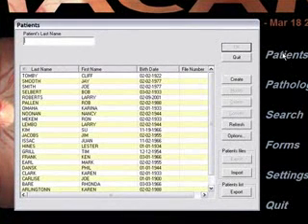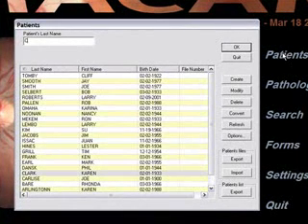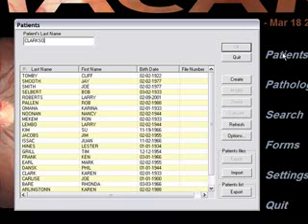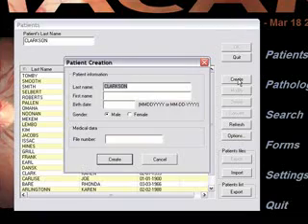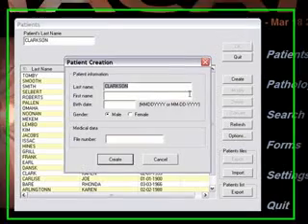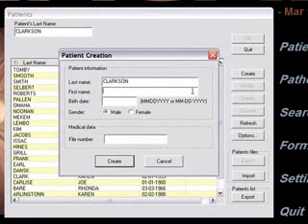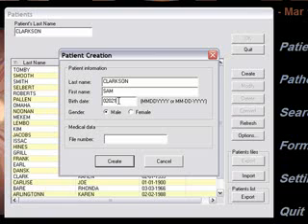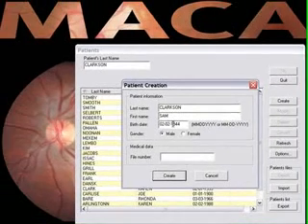Click on Patients. With caps lock on, type the last name, then click on Create. If the patient's name does not highlight in the list below, tab or mouse down to enter first name, birth date, and gender. Once completed, press Enter on your keyboard twice to start the picture-taking process.